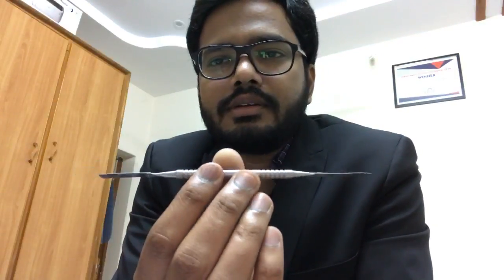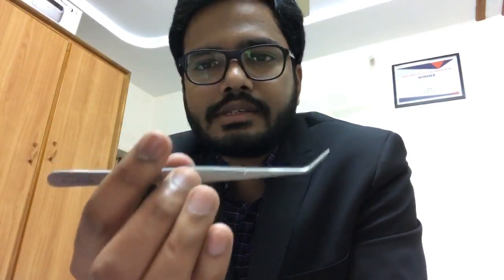Okay, this is clear. A 7 spatula. Okay. So this, I'm sure you all know this, right? Is it a locking type of tweezer or a normal one? So you also have, no, this is a normal one. Locking type of tweezer, you will have a provision for lock where if you press it, it gets locked in this position. So this is a normal one. We do not have the provision of locking. Yeah, we also have teeth.